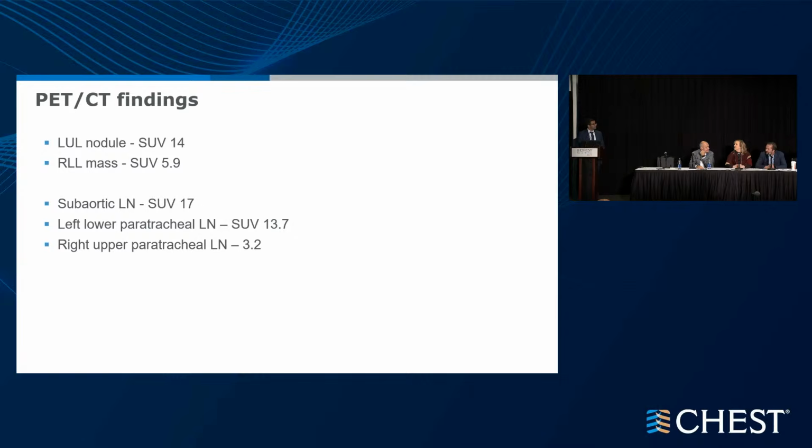Even without the PET, by CT criteria, these nodes were abnormal. Absolutely. And again, even by the size of these lesions, they deserve a full systematic survey. So I would do bronchoscopy first. I suspect we're going to find at least stage 3 disease in this bronchoscopy, and hopefully not have to go after that subaortic node, which would require a different procedure.